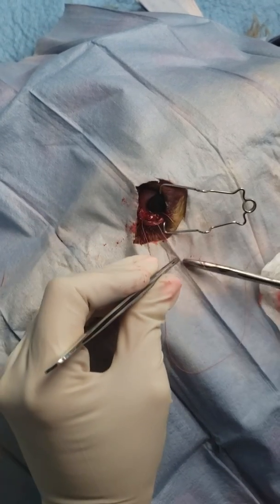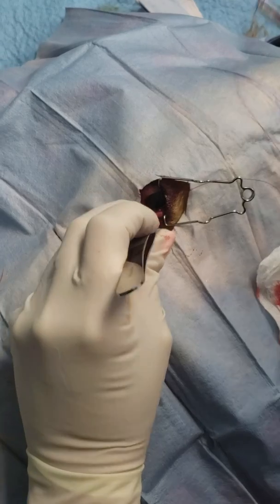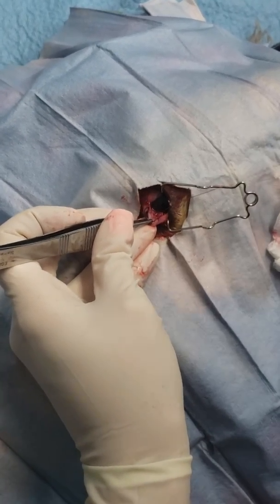It also helps to have some good eyelid retractors to keep things out of the way. If you don't have them, I tend to just use some stay sutures on each lid to kind of hold them out of the way.